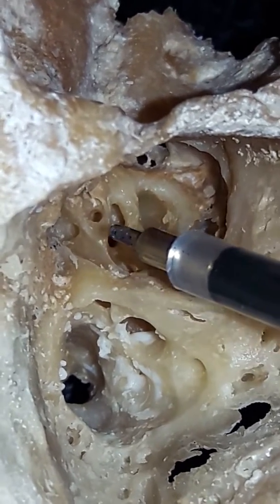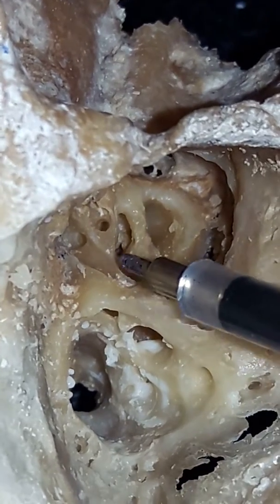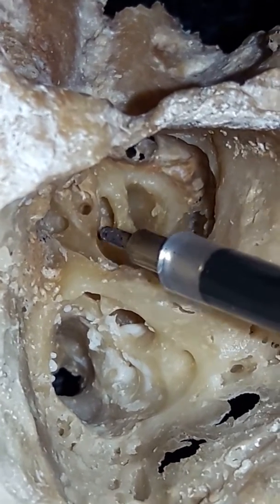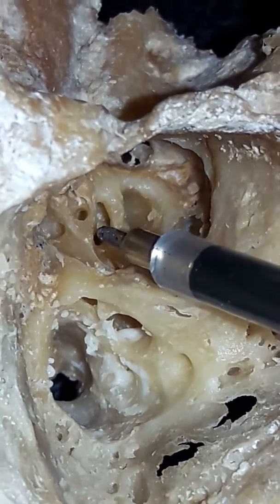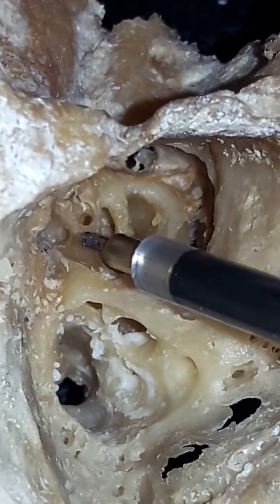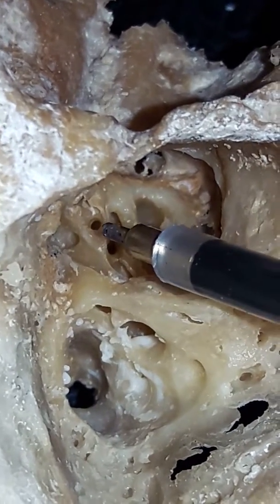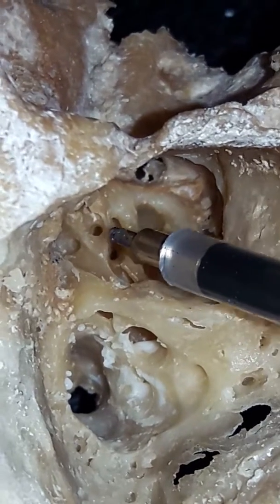If I go more than 2 mm anterior, when I am drilling deeper, my burr may hit the labyrinthine part of the facial nerve, which is present in the roof of the middle turn.